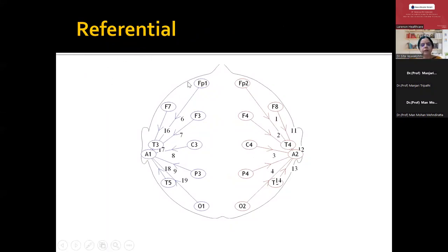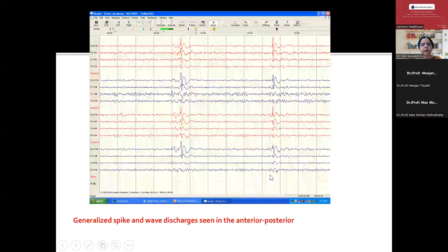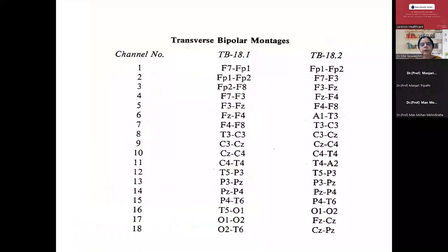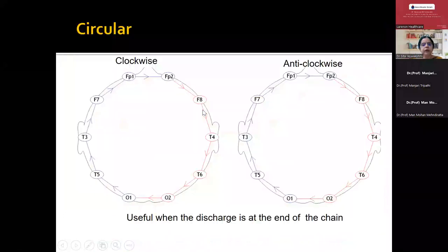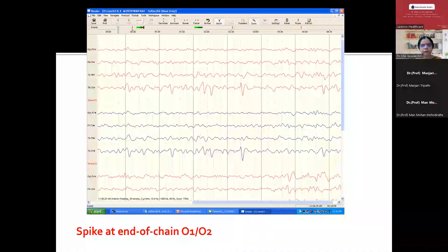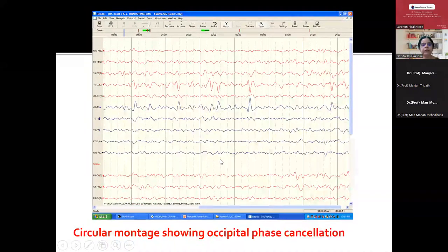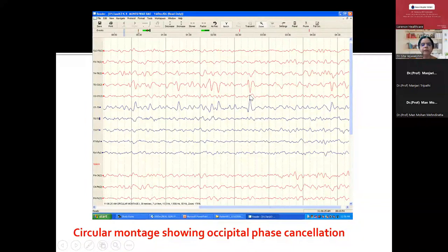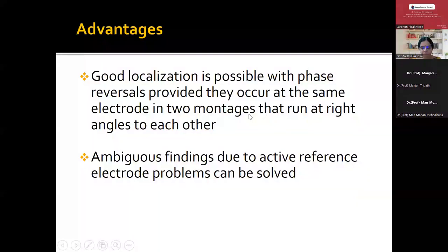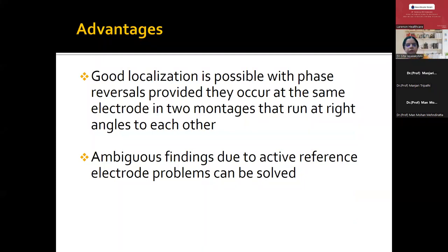Referential montage is where A1 is connected to all left side electrodes and A2 to all right sided electrodes. This is an example of a longitudinal bipolar montage. In a transverse montage again you see the spikes — clockwise connection and anticlockwise connection. In a circular montage, you are seeing the posterior spikes — by connecting them circularly, you identify that between the occipital leads there is a maximum phase reversal, suggesting that possibly the focus is between O1 and O2. The advantage with so many montages is good localization — a phase reversal which occurs at the same electrode in two montages running at right angles to each other confirms localization.